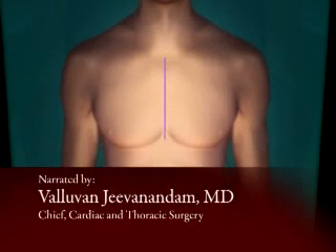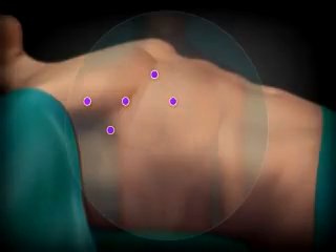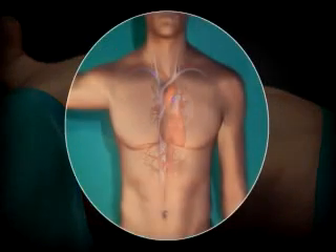Unlike traditional mitral valve repair surgery, in which the sternum is cut and spread open, in a minimally invasive robotic mitral valve procedure, the surgeon manipulates the highly advanced robotic tool and makes only tiny incisions. The robotic arms are inserted through the side of the chest, which is even closer to the heart than if we open the sternum.